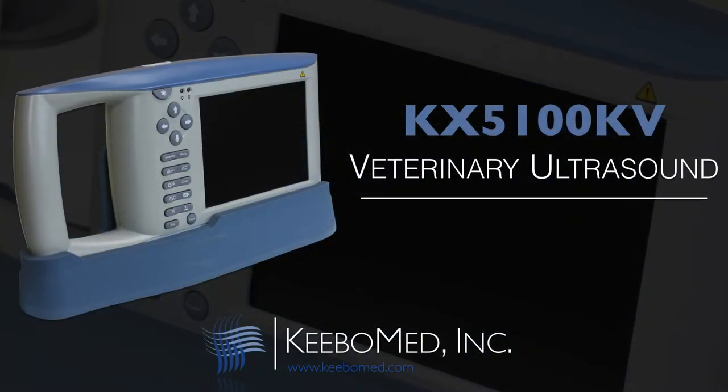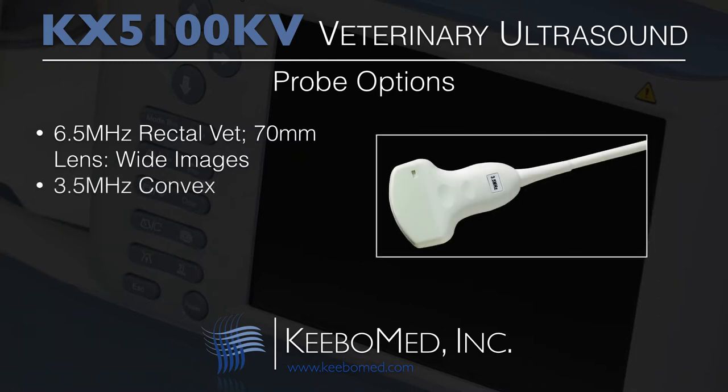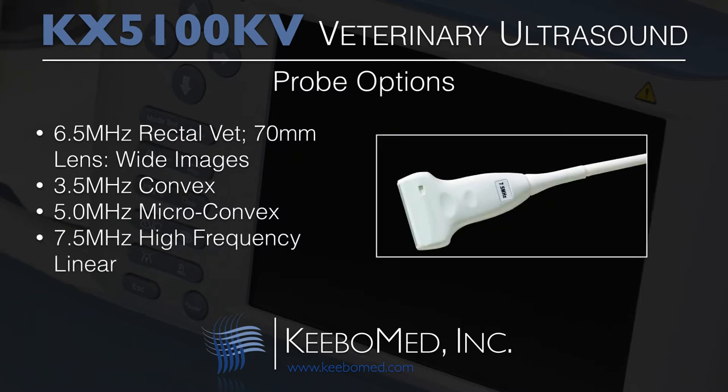The KX5100KV supports four different probes: a 6.5 MHz rectal VET probe with a large 70mm lens to produce wide images, a 3.5 MHz convex probe, a 5 MHz micro-convex probe, and a 7.5 MHz high frequency linear probe.